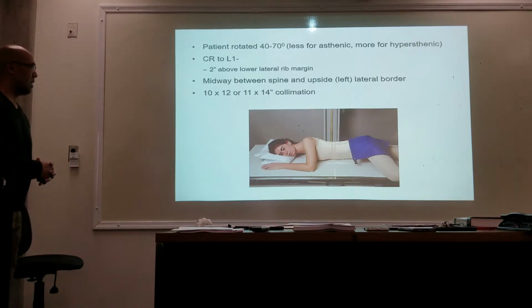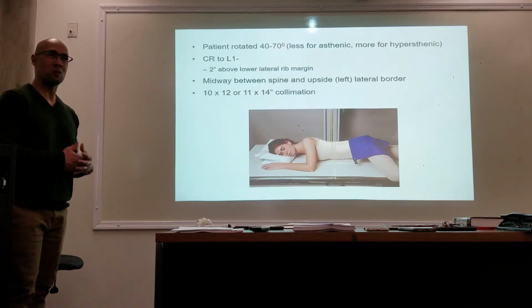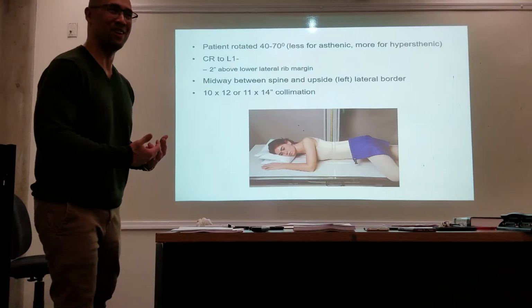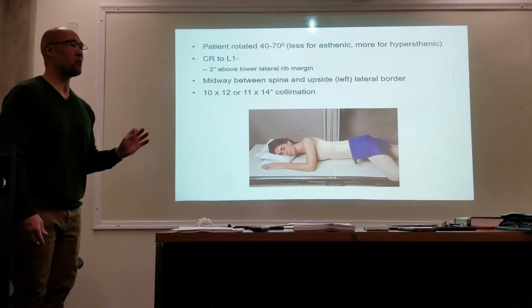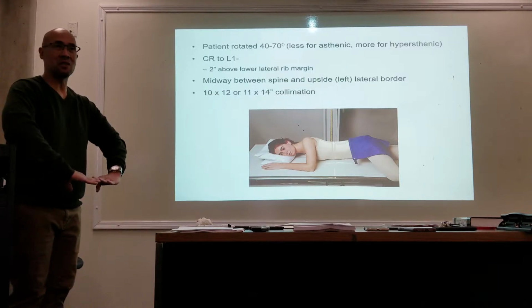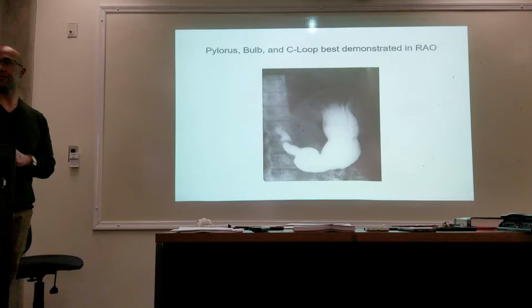Okay? All right. Now, once you position, what are you going to tell your patient to do? Do we want them to continue breathing? What are we going to tell them to do? Hold your breath, okay? Don't tell them to take a deep breath in. Just hold your breath, because the moment that they take a deep breath in, what happens to your diaphragm? And then what's going to happen to your stomach? It's also going to drop. So just have them hold their breath. We don't want the location of the stomach to change. Okay? All right.